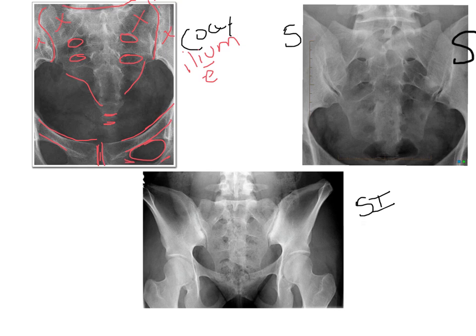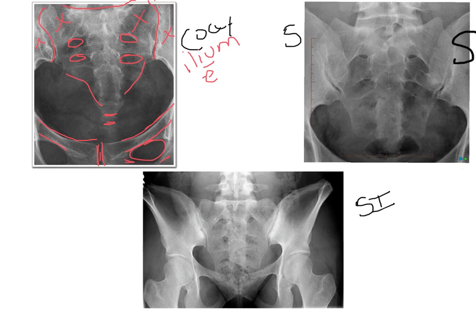Another thing that we are not seeing on here that helps with rotation, if we were to see the entire pelvic brim and pubis symphysis, is that we should see these little densities protruding upward from the pubis bones. And these are our ischial spines. You don't see them over here, nor do you see them on the SI joints, but we do have some images in the classroom that you can see. These ischial spines are also a good way to look for rotation.